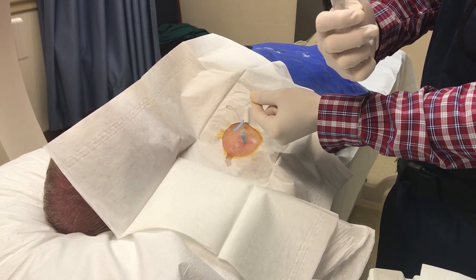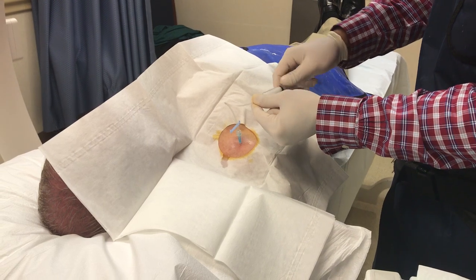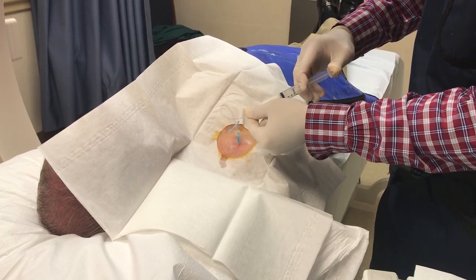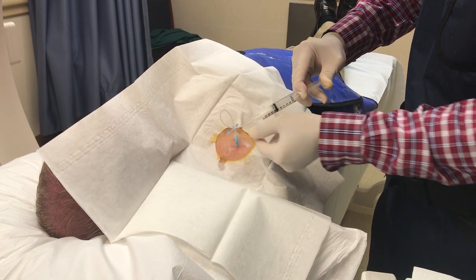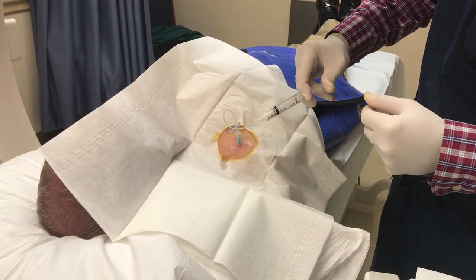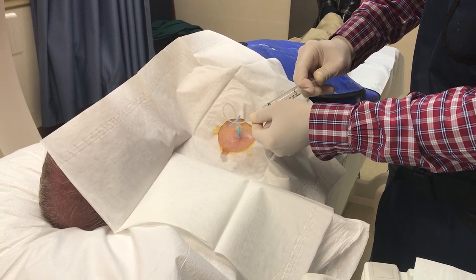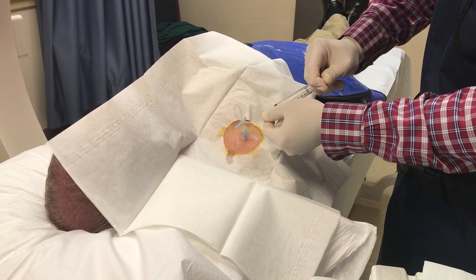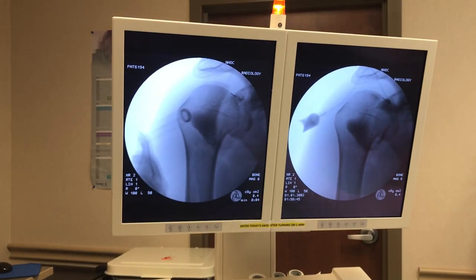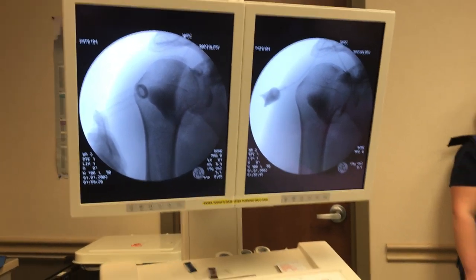We're going to inject the shoulder with the Depomedrol. I have 6 cc's of 1% lidocaine and 1 cc of 80 milligrams Depomedrol, and I'm going to slowly inject the Depomedrol into the shoulder. You can see — taking one more X-ray — the dye has been diluted a bit and spread out. So I can withdraw the needle here.